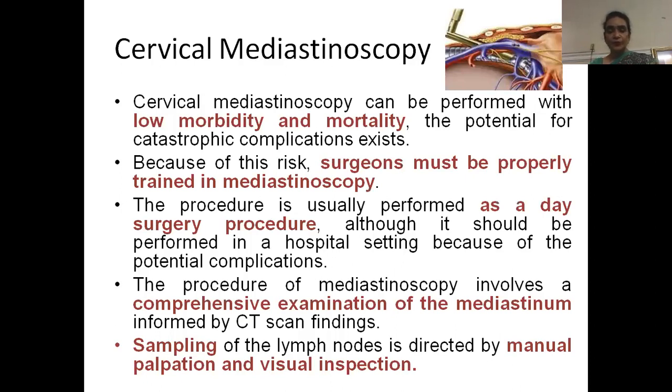Cervical mediastinoscopy, which is quite common, can be done with low morbidity and mortality, but has its potential catastrophic complications. Because of this risk, the surgeon must be properly trained in mediastinoscopy. The procedure is usually performed as a day surgery procedure, although it should be performed in a hospital setting because of the potential complications. The procedure of mediastinoscopy involves a comprehensive examination of the mediastinum informed by the CT scan findings. Sampling of the lymph nodes is directed by manual palpation and visual inspection.